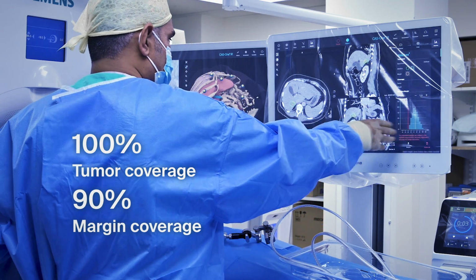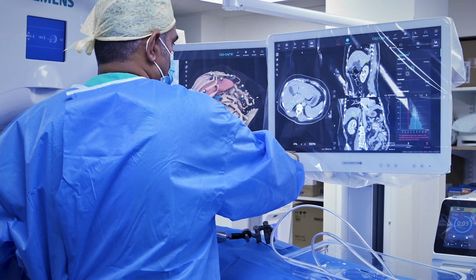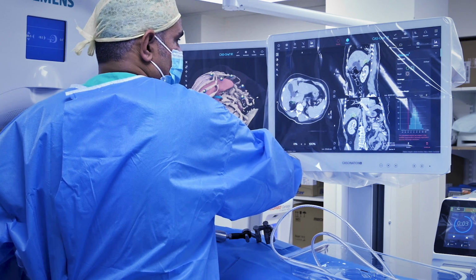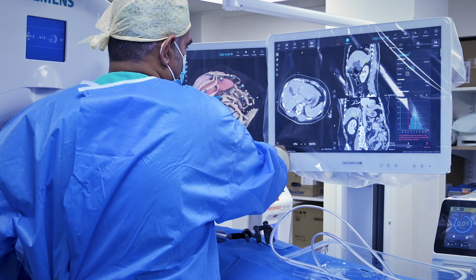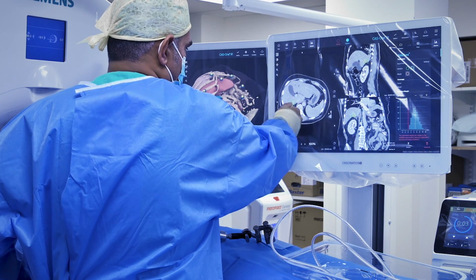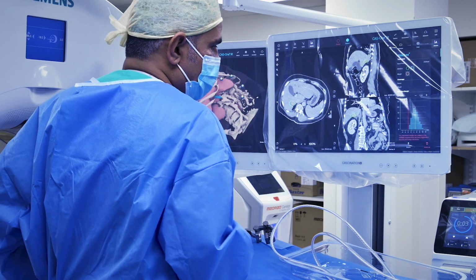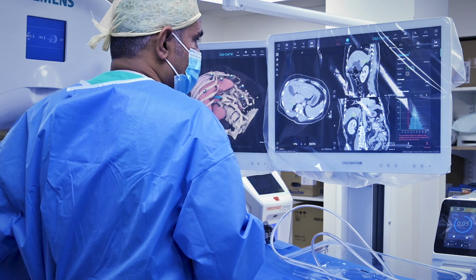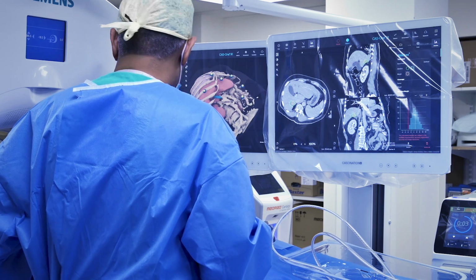Everything is to the right of the red line, which I like to see. We can see the tumour, which was here, has clearly been covered by the ablation zone. And so even though it's a subcapsular lesion, which means that you lose some, you're unable to measure the margin right around the edge of the subcapsular zone, but actually this looks to be a very good result, and I think we're happy with that. So I think we can stop there. I don't see that there's another need to do any further ablation.